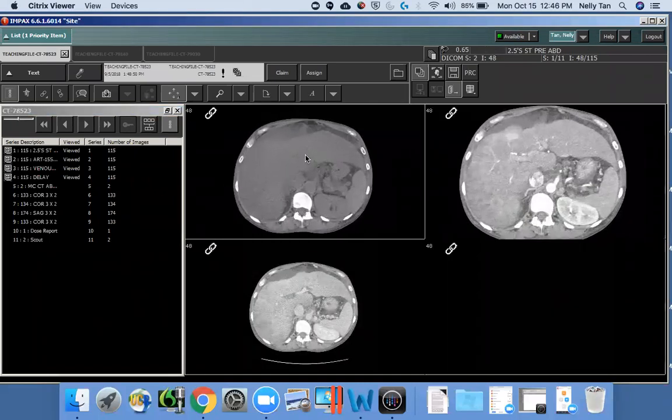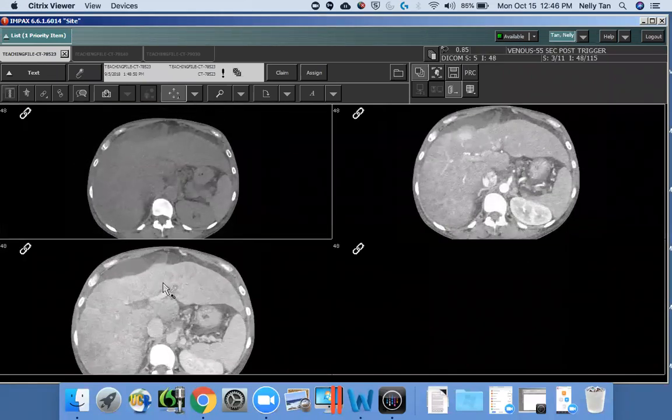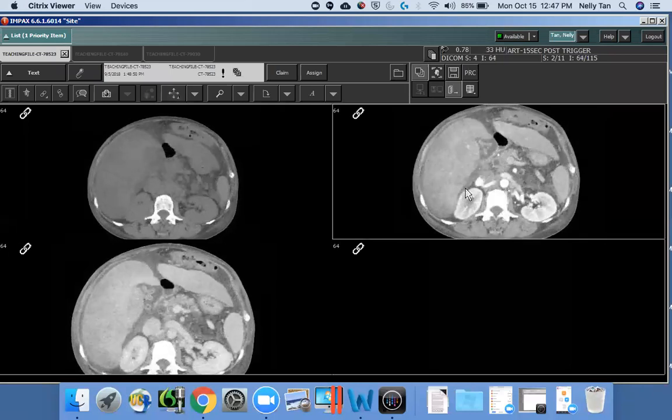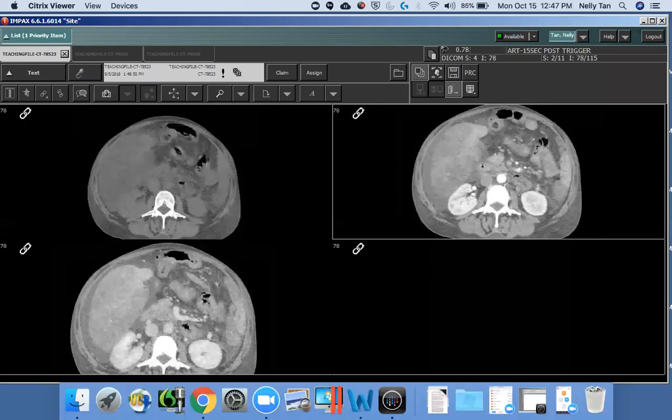I've seen some cases look like this that end up, when you do MRI, being a lot of steatotic nodular hyperplasia in the liver.